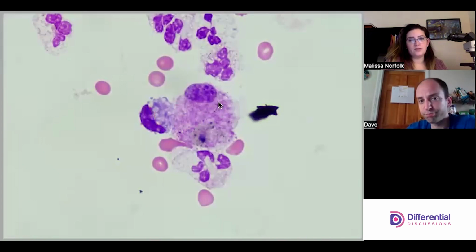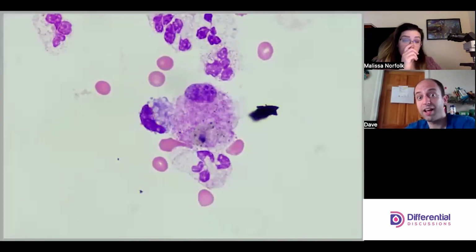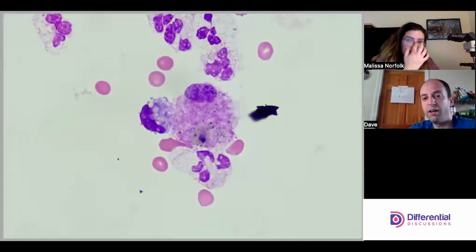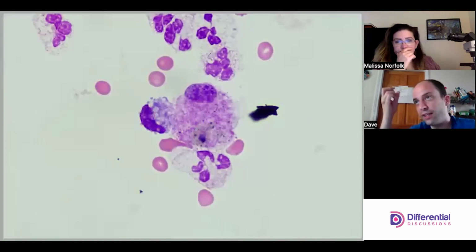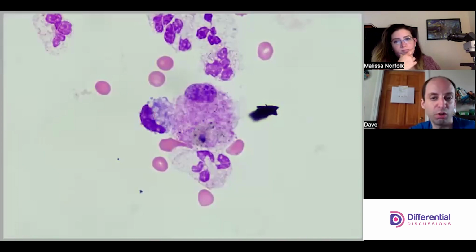This guy though has all those granules, like those malignant cells we saw in those CSFs. Yeah, it does. And the findings in the cytoplasm can be significant. But the other thing to consider is that this is a BAL, and this is a phagocytic cell. I don't know what it's been gobbling up in the environment, so I'm less alarmed about the granulation. And when I look at the nucleus, I'm reassured by the nucleus.